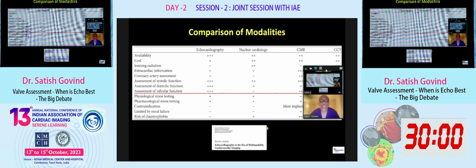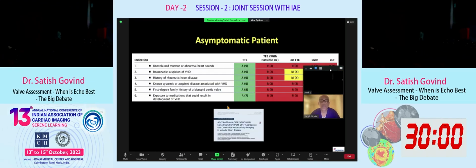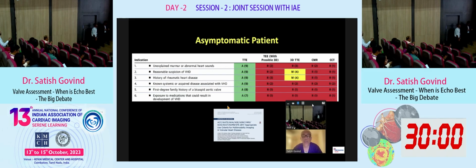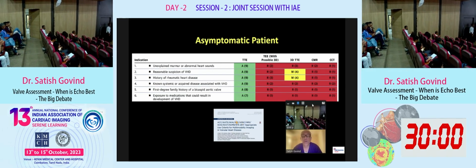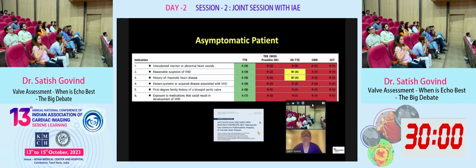Now, to set the tone, if you look at the comparisons here in terms of echo and CMR and CCT, you look at the valve itself. It has got a 3-star rating. That itself tells you that echo plays a big role. Now, let me look at the expert documents. You have a lot of these societies who have come together and set the criteria, what they call appropriate criteria.